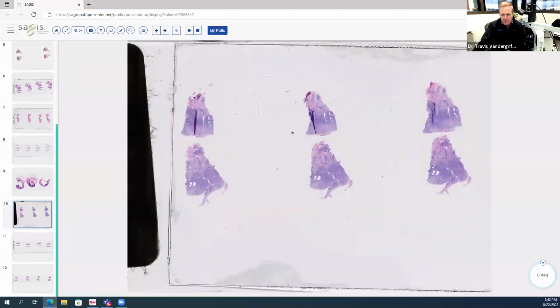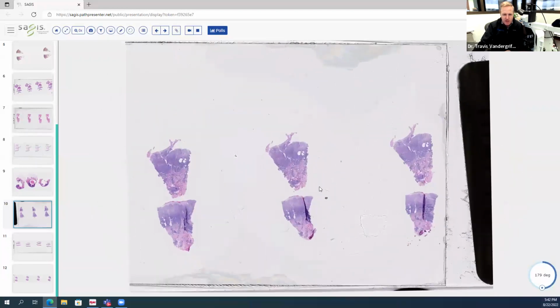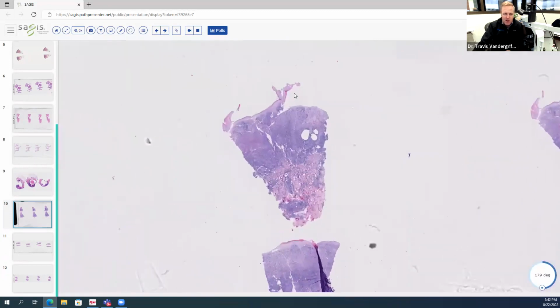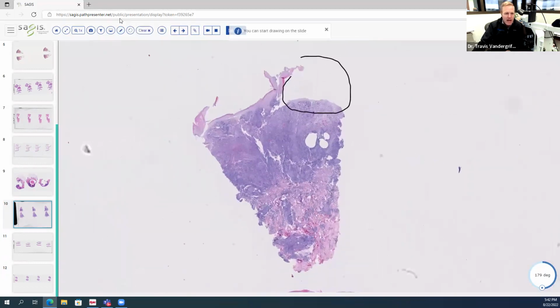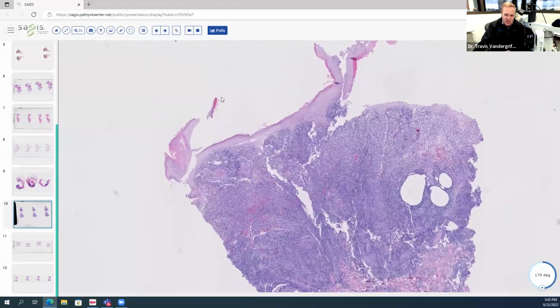Okay, next case. A punch biopsy into an ulcerated plaque or an ulcerated papule. The epidermis on this side is showing us a defect. That's the ulceration. And then the primary process is this dense and diffuse dermal infiltrate. So you've got a really dense dermal infiltrate here. It extends even deeper, but very dense up top. I'm also noticing that the overlying epidermis is acanthotic.